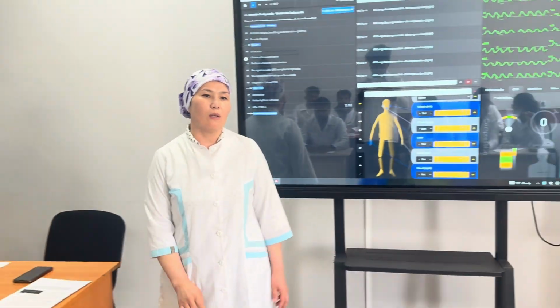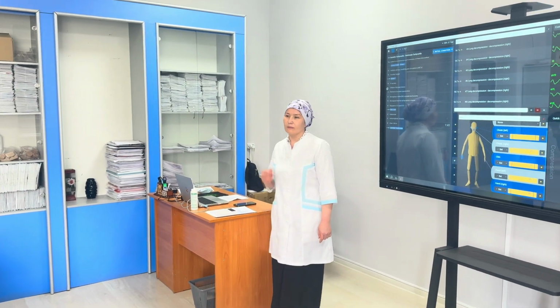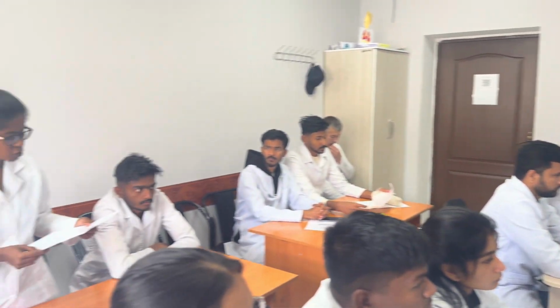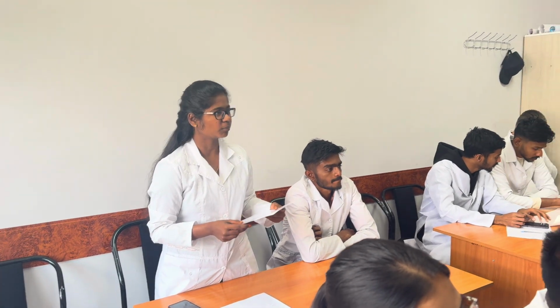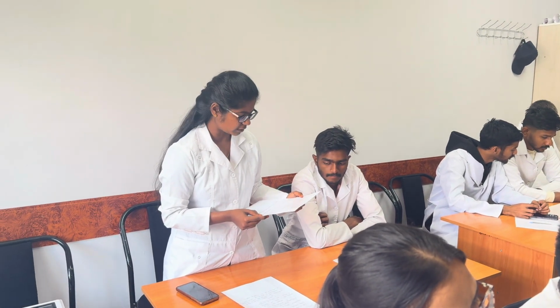Now, fourth group please, ECGs. By the given ECG, we can find that this is a Mobitz 2 AV block. In this ECG we can see some changes, like constant PR intervals, and we can see the QRS complex missing, the dropped QRS complex. This happens due to the loss of ventricular contractions without prior extension of the PR interval, and the pulse delay at the AV node. Due to the missing QRS complex, the ventricular rate will be slower, and the rhythm also will be slower.